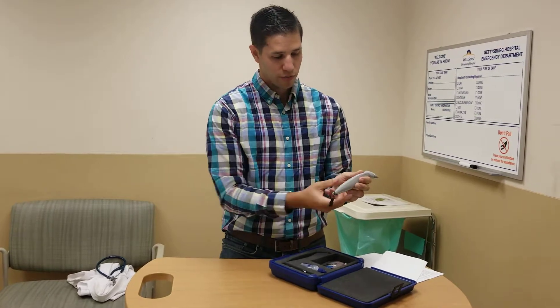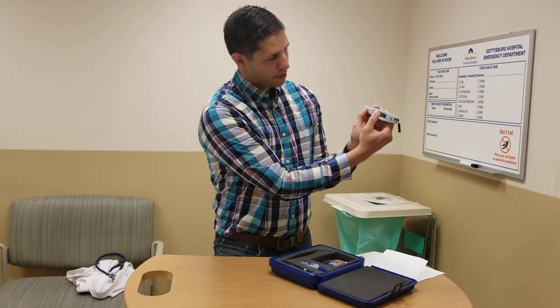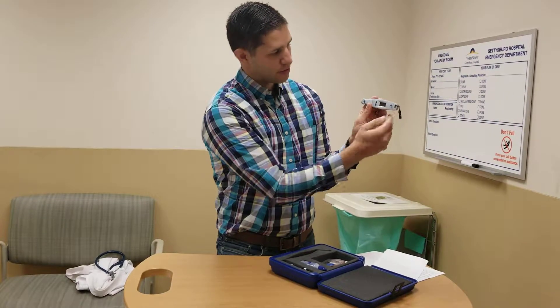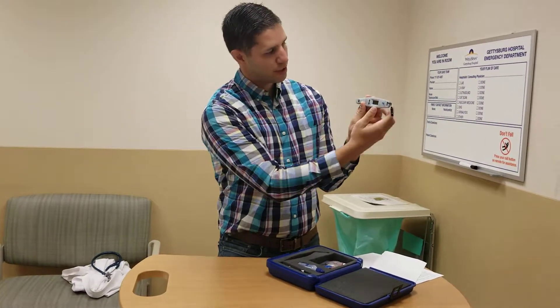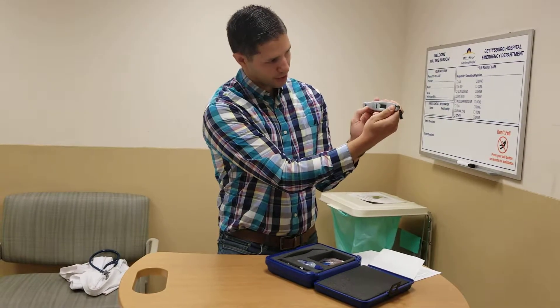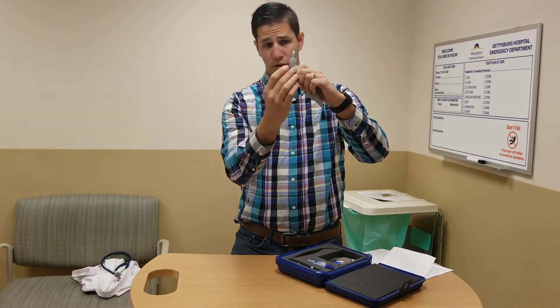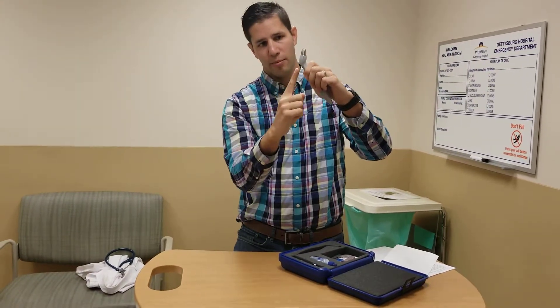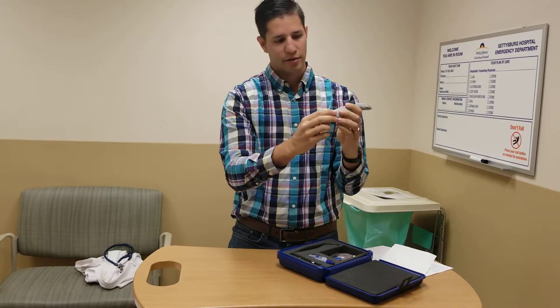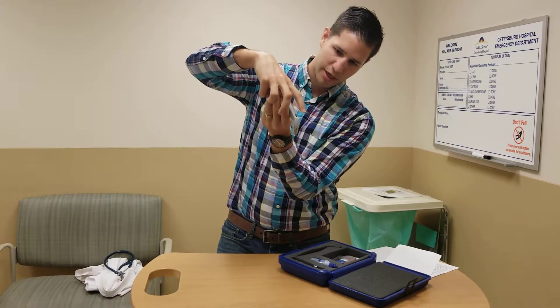If you need to calibrate it, press and hold all three buttons simultaneously for about three seconds. It will then say 'probe horizontal' — hold the entire probe horizontal and press the action button at the top. It then says 'probe up,' referring to the probe tip, so put that vertically up in the air and press the action button again. It then says 'probe down,' so turn the probe down and press the action button again.